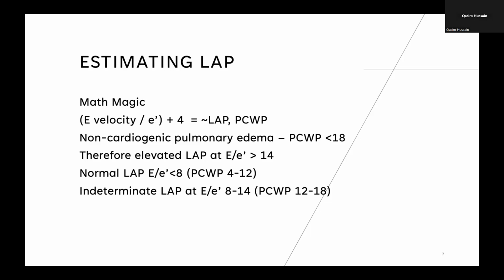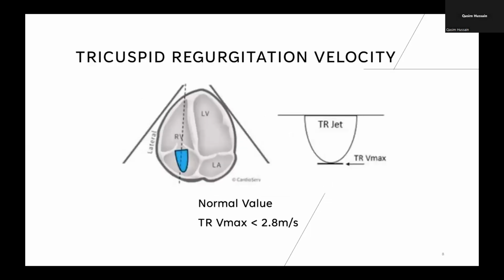So with that being said, you move on to measuring your tricuspid regurgitation velocity. This is now the third quantitative measure we're doing, and this is the one that's probably fraught with the most error, just because it's difficult to get these views, and it's also very difficult to line up your continuous wave Doppler, the one with the diamond and not the pulse wave, completely parallel with your tricuspid regurgitant jet. And you can do this in multiple views.